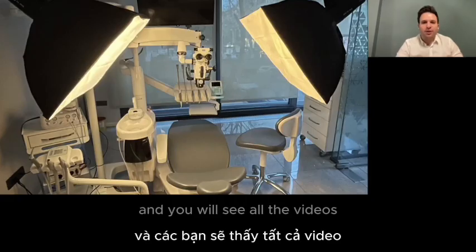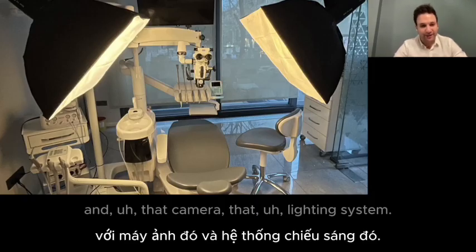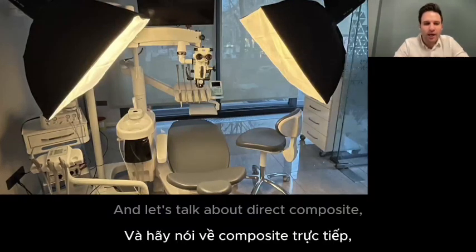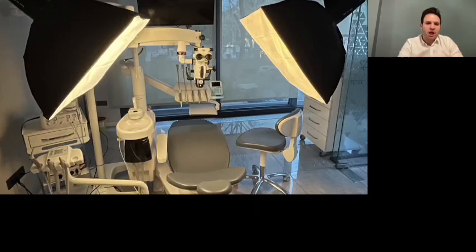And you will see all the videos and photos which were taken under that microscope and that camera and lighting system. And let's talk about direct posterior composite restorations.